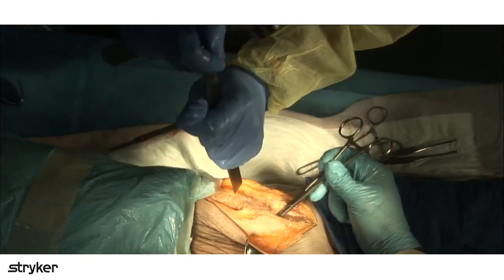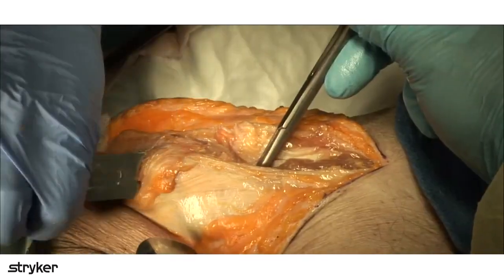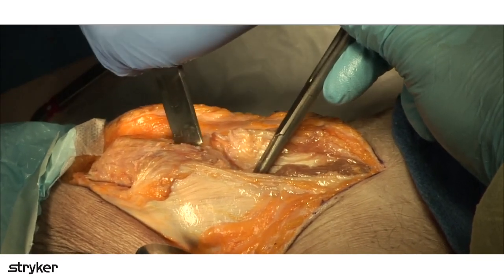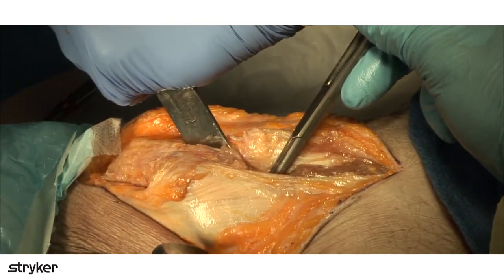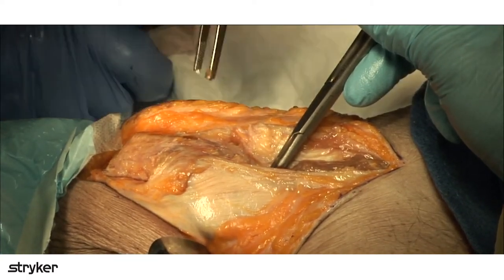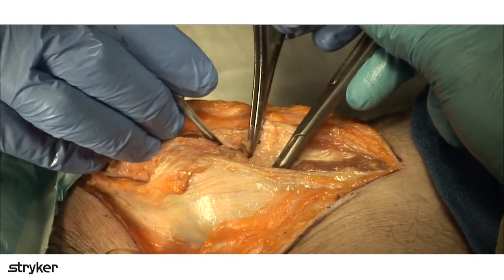You can use a curved osteotome and make it almost semi-lunar. Because it's a digastric osteotomy, it ends up being very stable and you have less of an issue with it pulling off. I haven't seen any of these come off after fixation. I don't think you have either, have you, Claude? Nope.